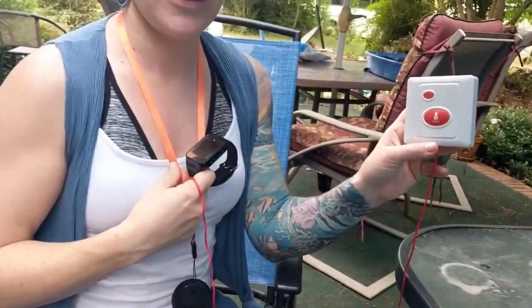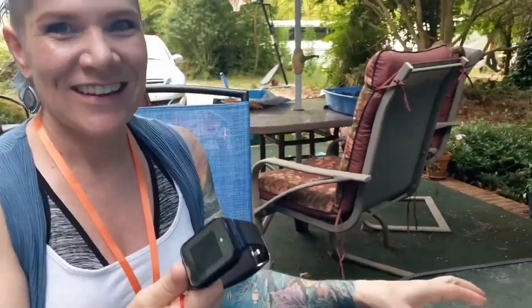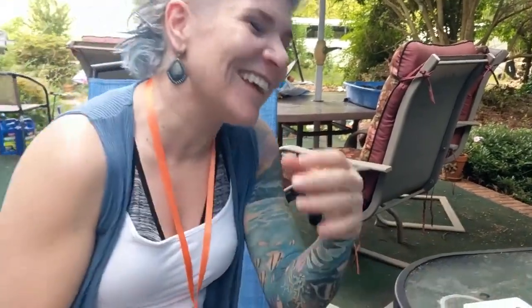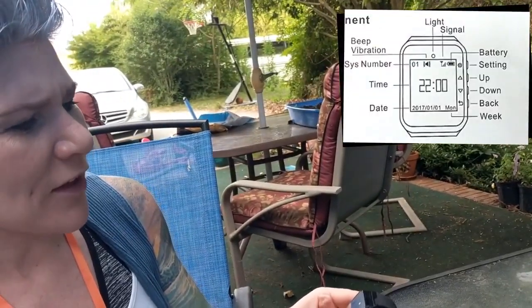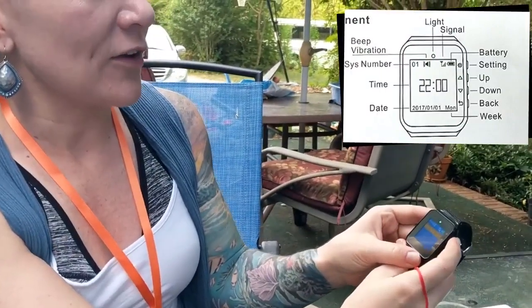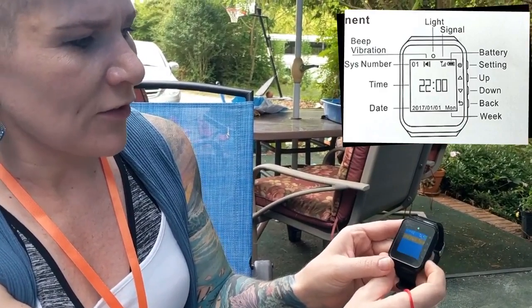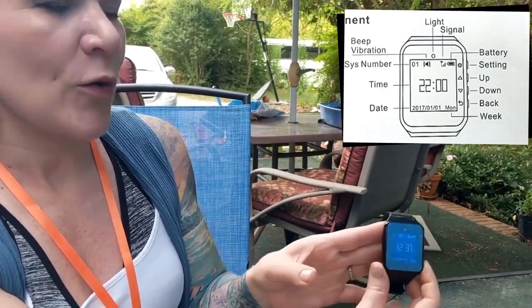If I don't have either of these, how do I make the watch tell me what time it is? Click the button. Oh my gosh. There are four buttons on here. There's the top one that I don't know what that is - it looks like a screw. It's the setting, on/off. And then you've got the arrow up and arrow down, and then you've got the back.